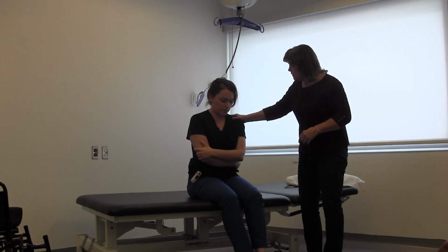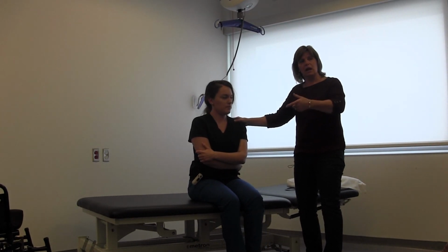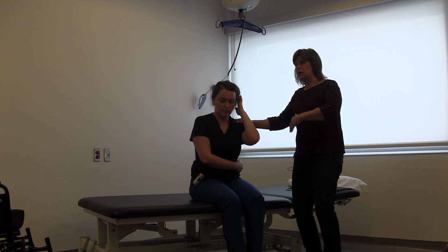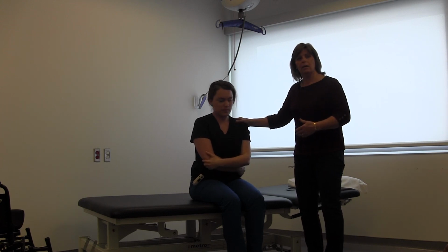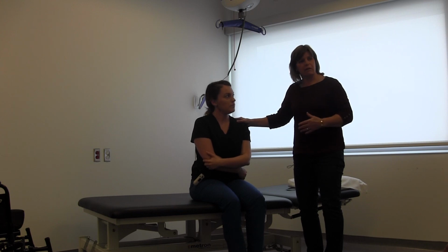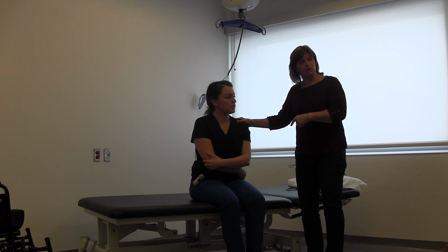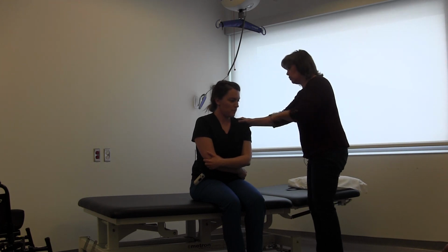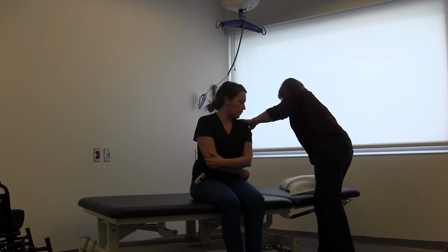How's that feel? Okay. So the most important thing is how I shifted my body. We're using a lever system to actually get her sitting up, okay? I did everything there for her, but if we wanted to, we could get her to participate as well. So what we're going to do is run back down, which is the opposite of what we just did.